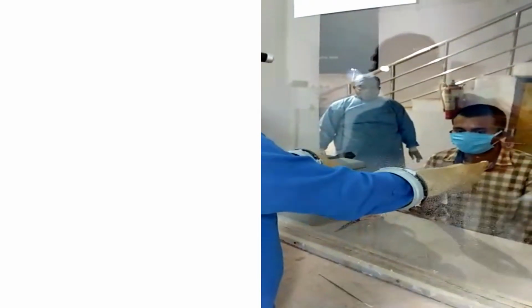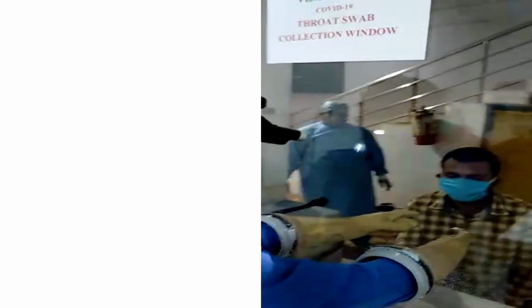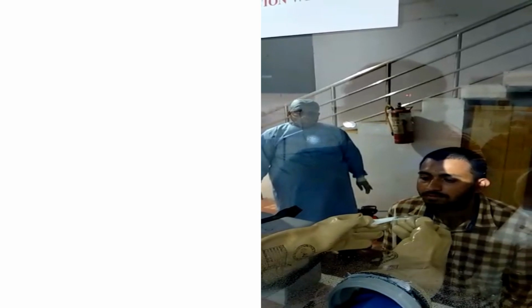The doctor is inserting the hands again through the glass pane. So he has taken the swab, removing it, just taking it out, and that is the swab with which the sample is taken from the throat.